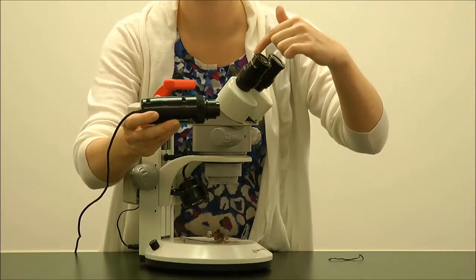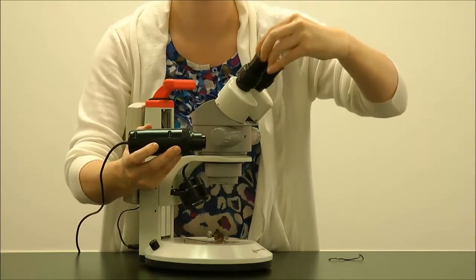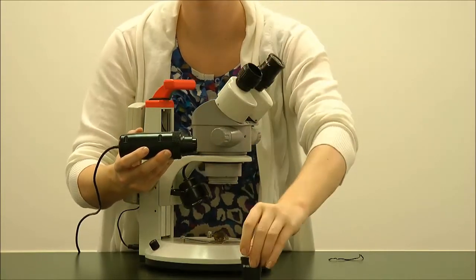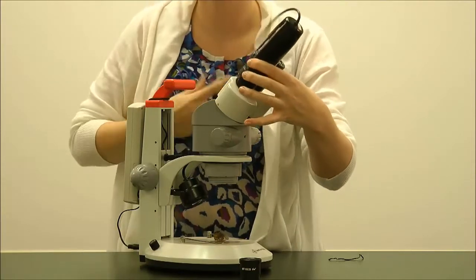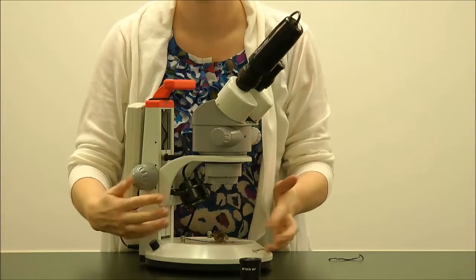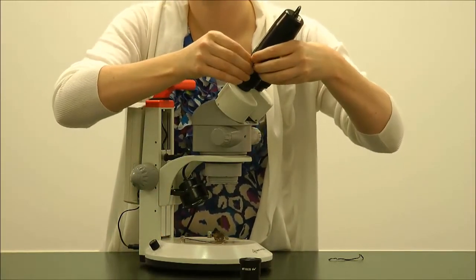Remove the eyepiece from the stereoscope and very easily slide the PupilCam into the body tube. Now your stereoscope has become digital and you can use Applied Vision 4 software. When finished, replace with the microscope eyepiece.